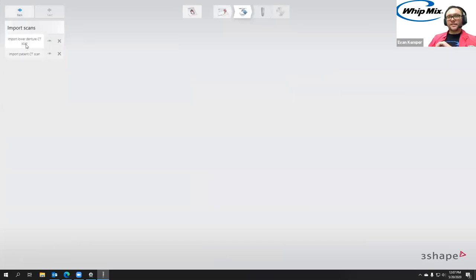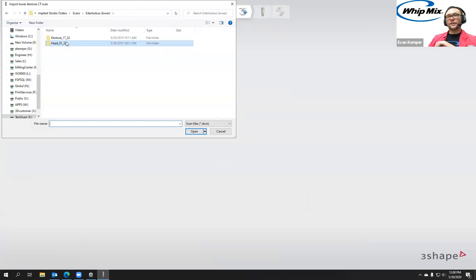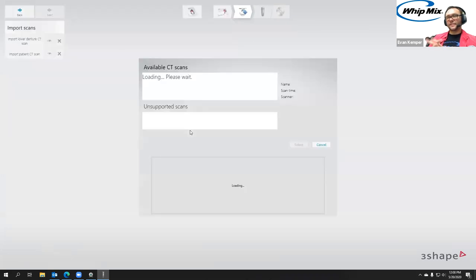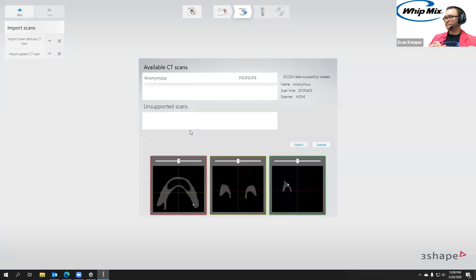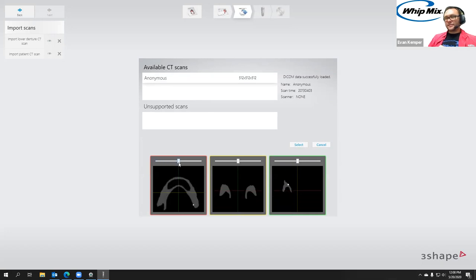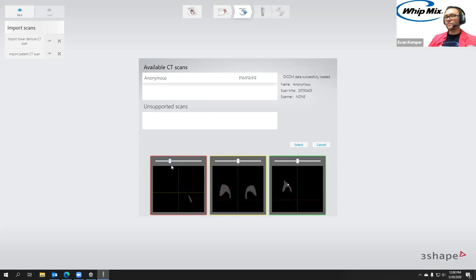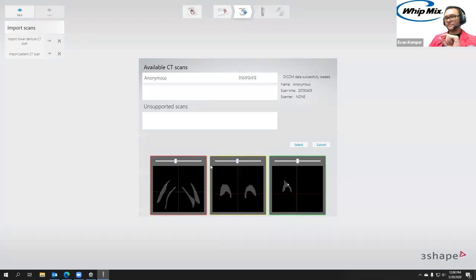So we have our two scans that we need. The first one is the lower denture CT scan, so I'm going to click that and go into where I have my denture saved and open it. We have sliders where we can slide through, and you can see we have the surface of the denture, plus those little white spots — those are the radiopaque markers. Those will remain on the denture even when it's outside the mouth, and they're what's going to allow us to line the two scans up.